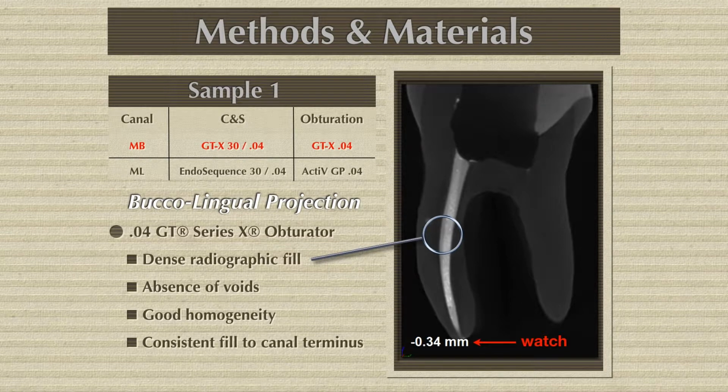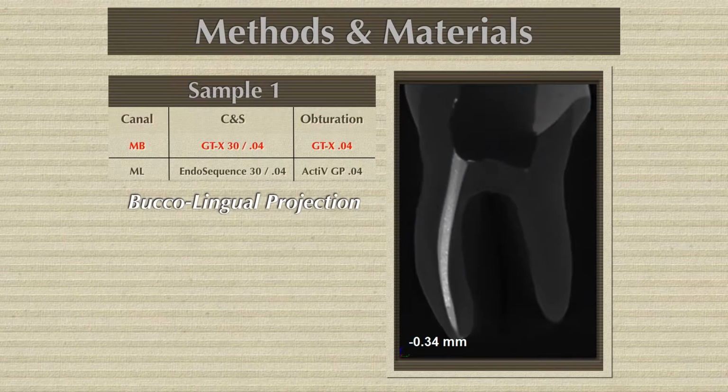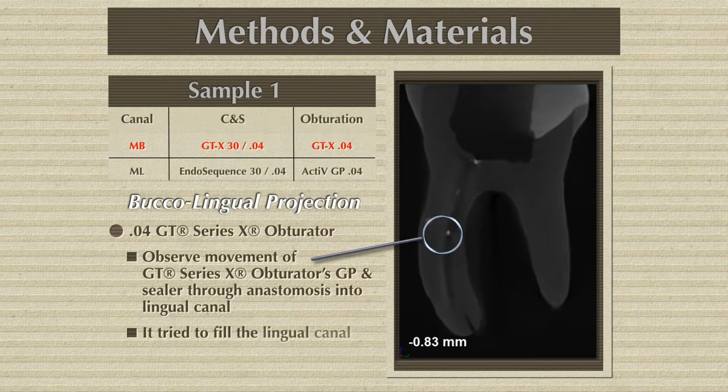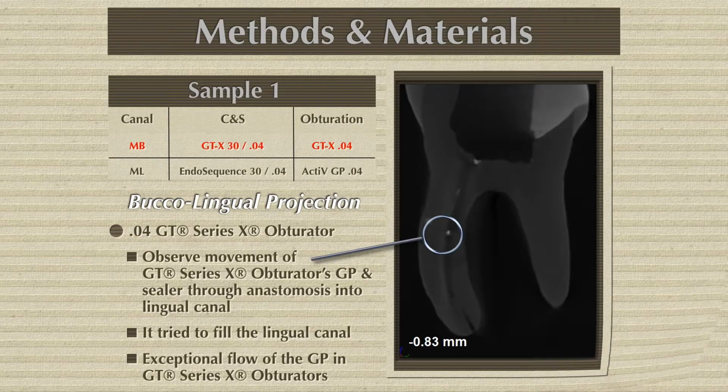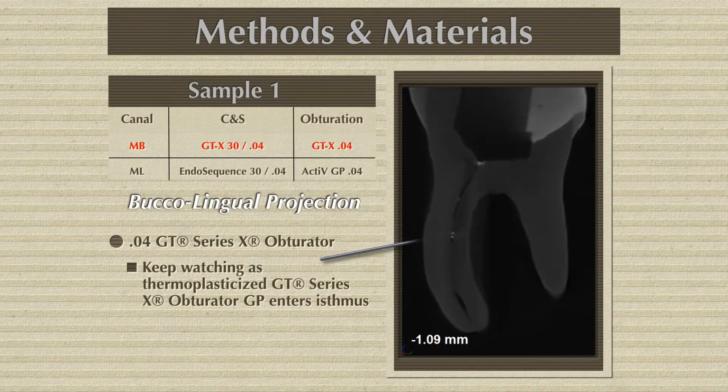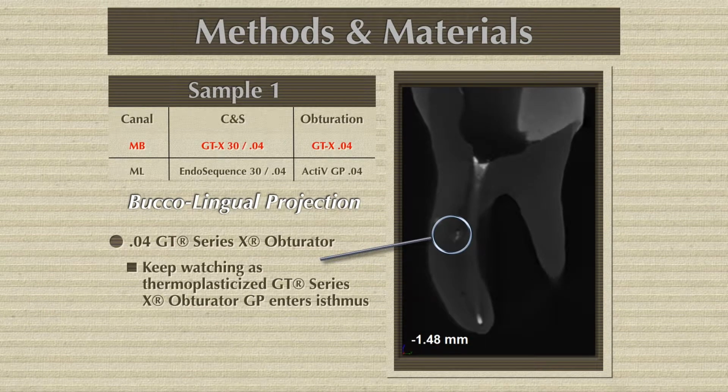We are going from buccal to lingual. Okay, and look what is happening here in this isthmus. How the gutta-percha and cement are flowing. Now we're going from buccal to lingual, and we use the GTX obturator, which is the Thermafil. It has a plastic core, and we can see here the sections.